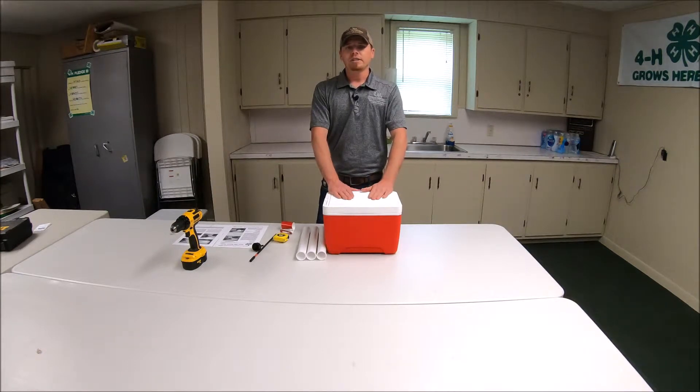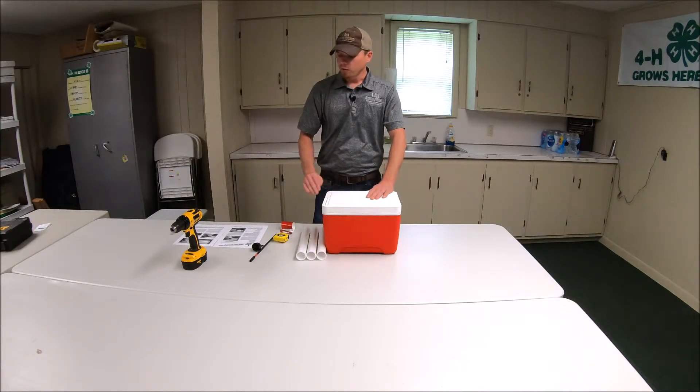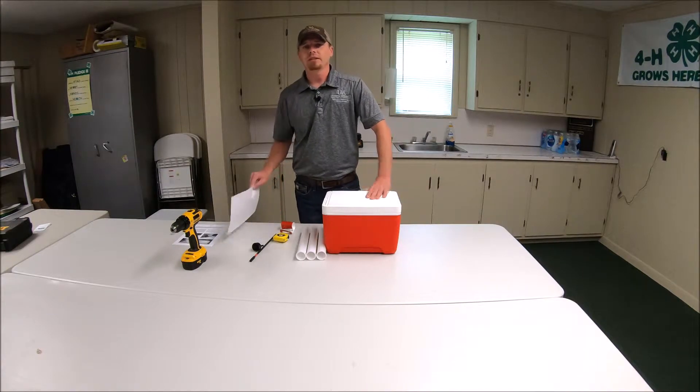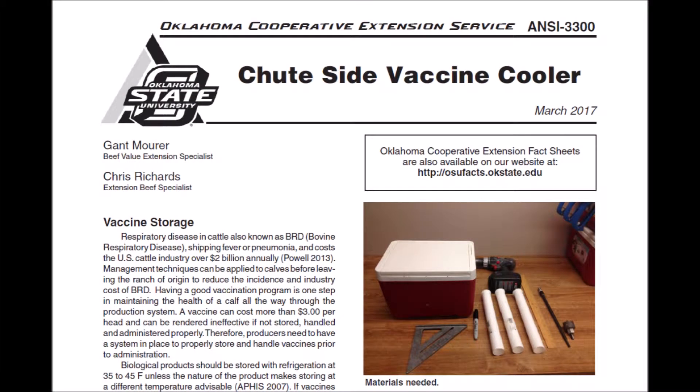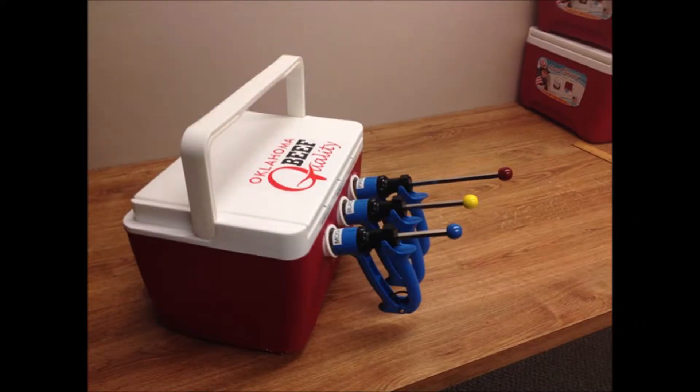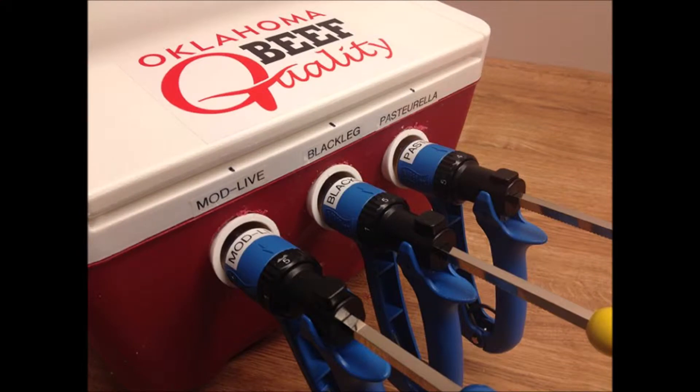What we're going to do today is build a vaccine cooler. It'll have three different holsters to hold three syringes. The information comes from the Oklahoma Cooperative Extension Service, publication ANSI-3300. You can find that on their website — just Google 'do-it-yourself vaccine cooler.' It's really easy to find and very comprehensive, and I'll be referencing it throughout this project.